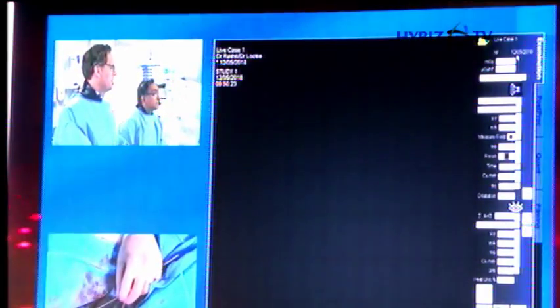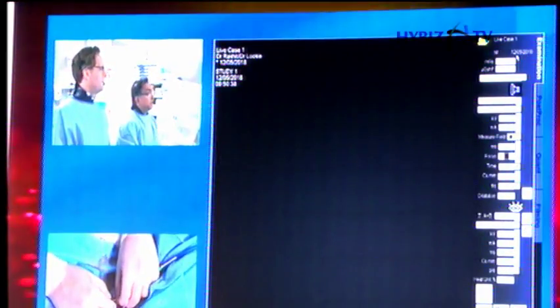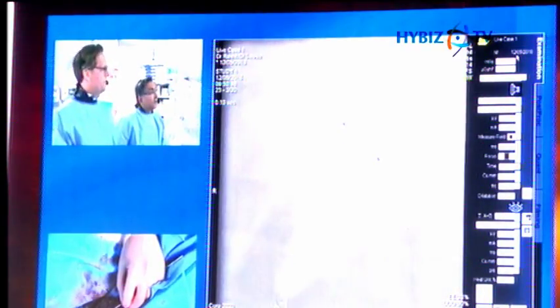Pardon our ignorance, but is this a drug-coated platform? It is. Sirolimus, yes. It's coated with sirolimus. 16 atmospheres. Nice. Good. Down. And maybe come back. Go up. Go up. Atmospheres. Down. Sorry about the pain in the chest.